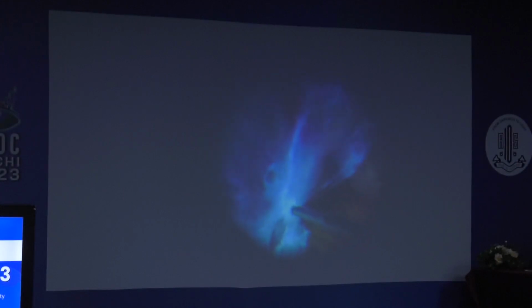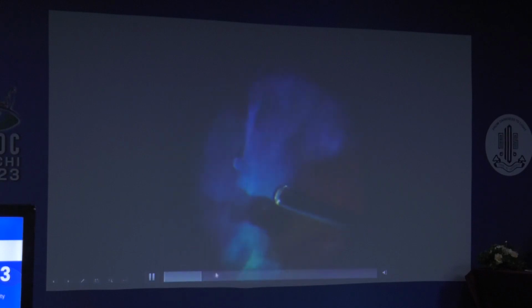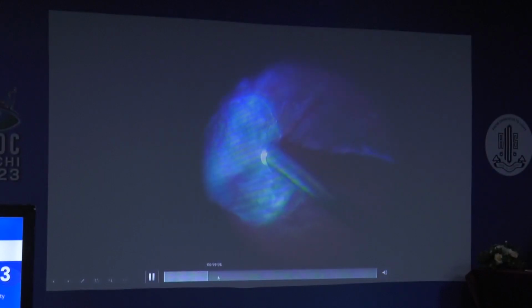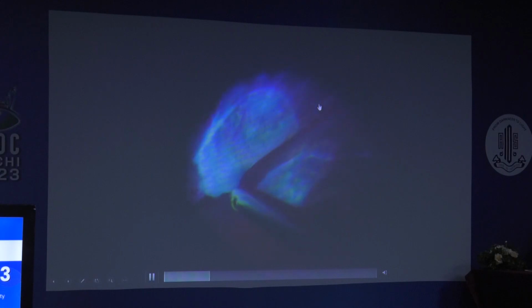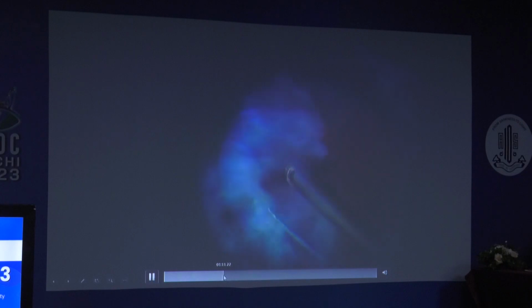So here what I am doing is creating a mini kind of PVD, because I could not find a plane. And after that, once it's slightly lifted with the help of forceps, then the insinuation of the instruments in between the healthy retina and this membrane becomes slightly easier. So I have segmented this, and we will do this process everywhere in between the bullae of detachment also. You take it, but with least possible suction, try to truncate all this.